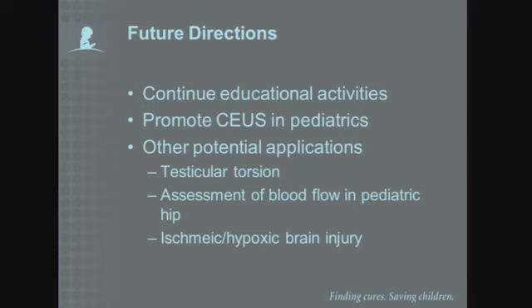We will promote contrast ultrasound in children, and there are other applications that are currently being investigated, including testicular torsion, contrast ultrasound in the assessment of blood flow in the pediatric hip, and contrast ultrasound in ischemic and hypoxic brain injury in children. And this is a very exciting time for this modality in children, and I'm sure that it will continue to grow in the future.